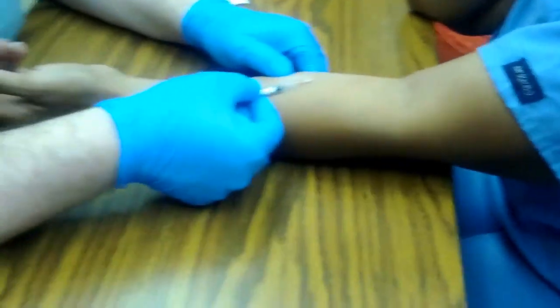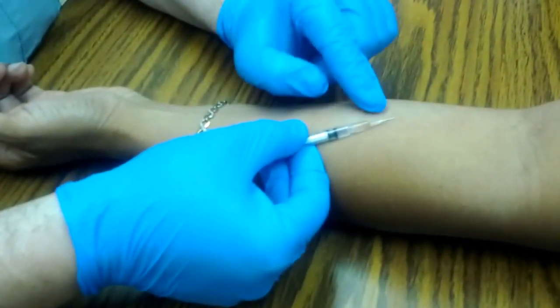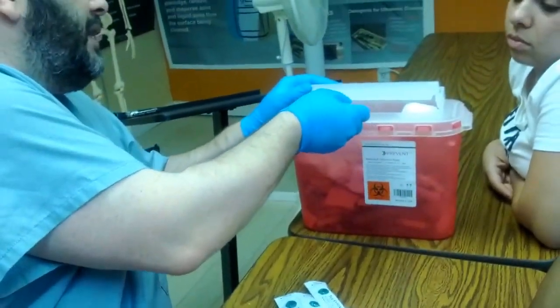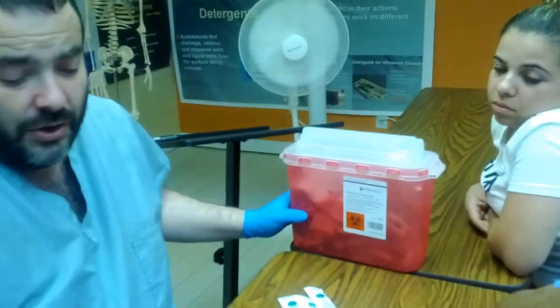With a doctor, you inject the entire amount. As far as the class is concerned, only until the bubble is formed. And then I'm going to take the syringe out just like so. And without any further delay, I'm going to put it into our sharps container just like this. Never put your hands inside. Just close it. And you're in good shape.